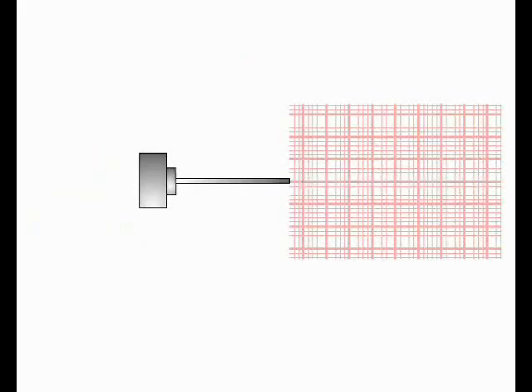It is very important to realise that all of the ECG leads on the ECG machine are set up in such a way that depolarising current moving towards a lead produces a deflection on the ECG paper above the isoelectric line, a positive deflection, while depolarising current moving away from the lead produces a deflection below the isoelectric line, a negative deflection. In contrast, repolarising current has the opposite polarity to depolarising current. Therefore, repolarising current moving towards a lead produces a negative deflection on the paper, while repolarising current moving away from the lead produces a positive deflection.